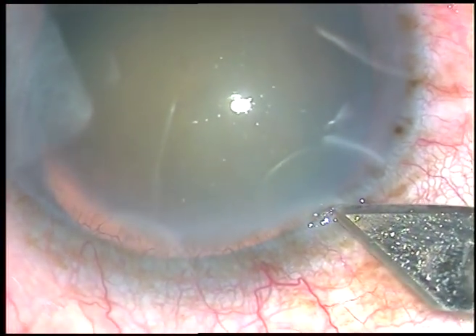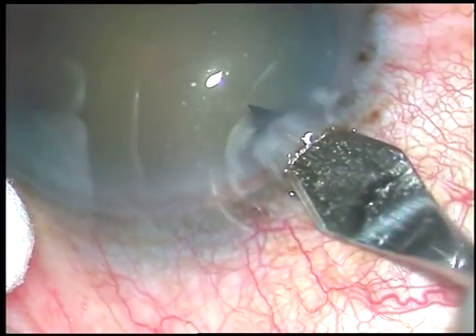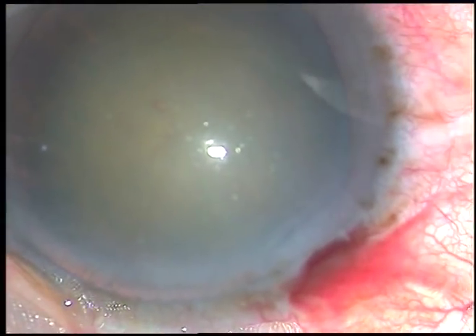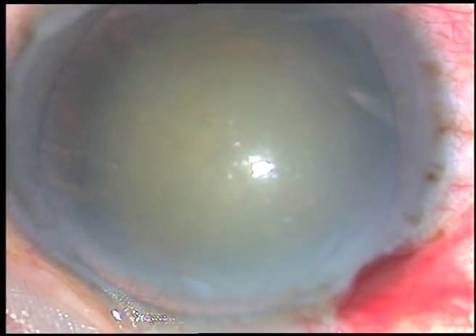Dear colleagues, this is a cataract with grade 3 nuclear sclerosis and well dilated pupil. I didn't expect any challenge in this case, but let us see what happened and how I managed the odd situations.